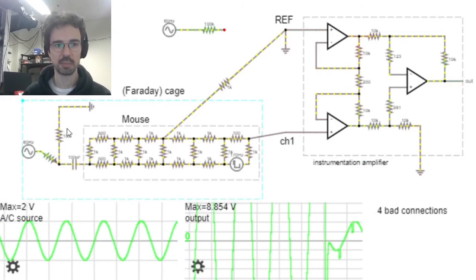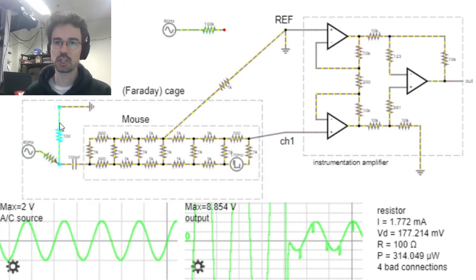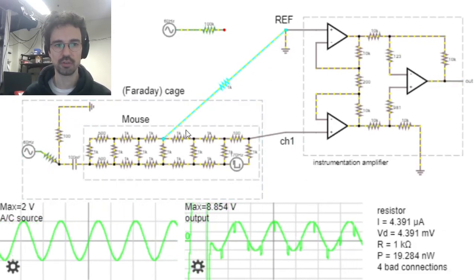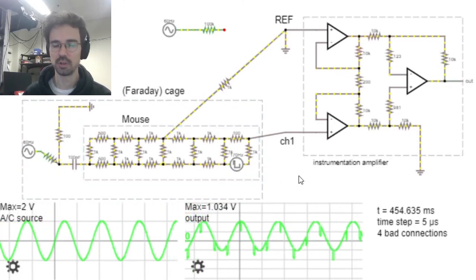You can see that because of the voltage divider that I put here, so basically I have not assumed that I've done a perfect job at getting the environment to ground level, it has made our recording much nicer, because now our ground screw doesn't have to work quite as hard in bringing the animal to the correct voltage level.